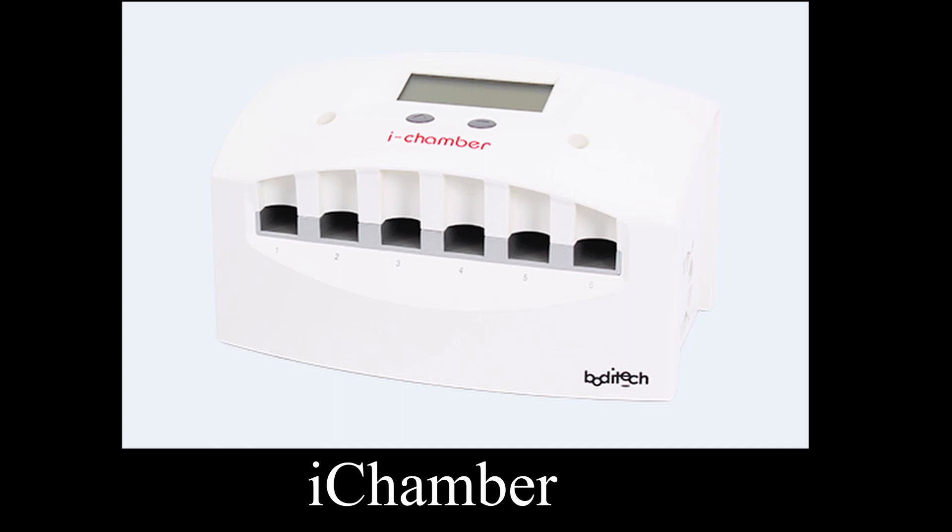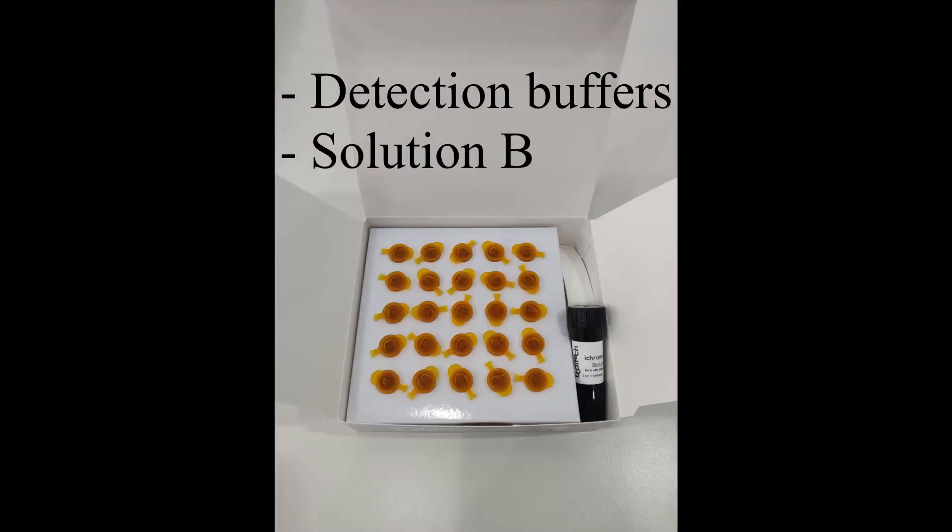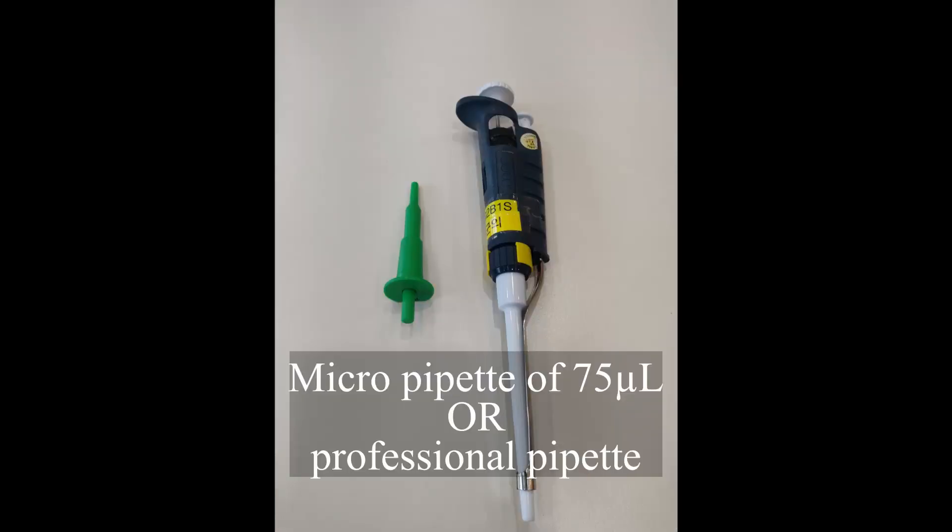T3, T4 components: iChamber, iChroma reader or iChroma 2, Reagent Kit, Detection Buffer and Solution B, micropipette of 75 µL or professional pipette. Let's start the test.